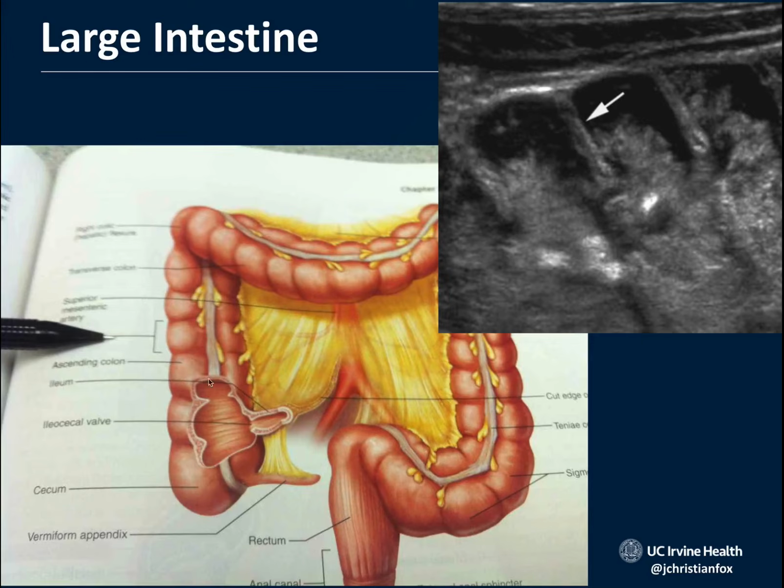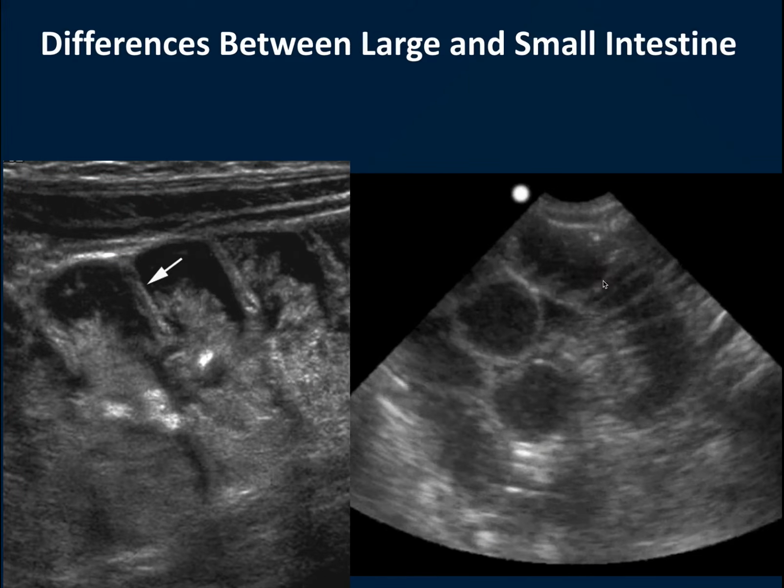And yeah, oh, here we go. You can see maybe some of this haustra coming along here in this cross-sectional drawing by Netter. Haustra, haustra, haustra, haustra here. And this is what it looks like on ultrasound. Pretty distinct. You can see these regions here, which is distinct from plicae circularis.